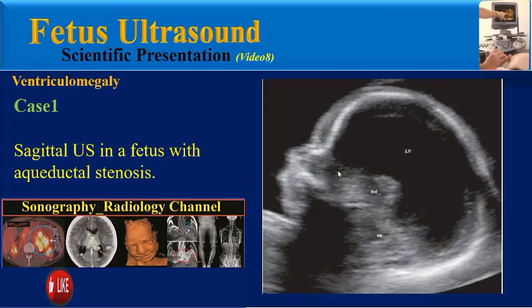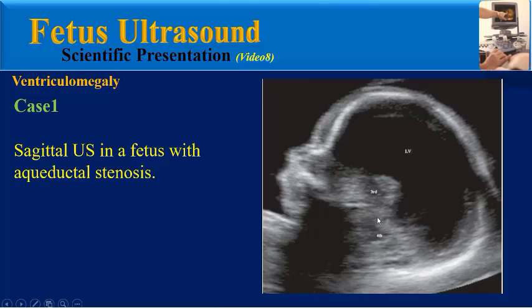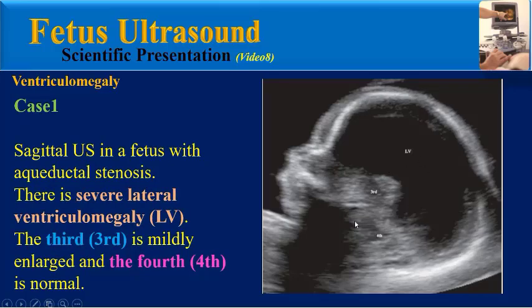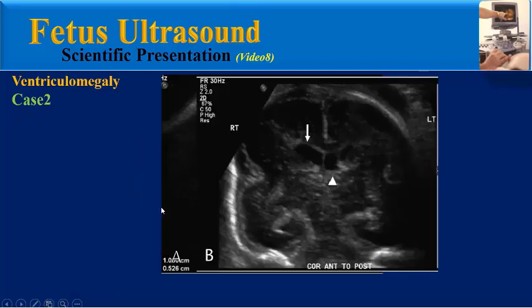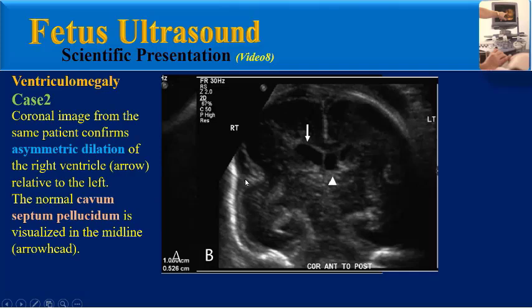Teaching Case 1: A sagittal ultrasound image in a fetus with aqueductal stenosis shows severe lateral ventriculomegaly. The third ventricle is mildly enlarged and the fourth ventricle is normal. Case 2: An axial scan at the level of the atria demonstrates isolated mild right ventriculomegaly. The choroid plexus dangles against the lateral atrial wall, and there is a 7 mm gap between the medial ventricular wall and the normal choroid plexus.